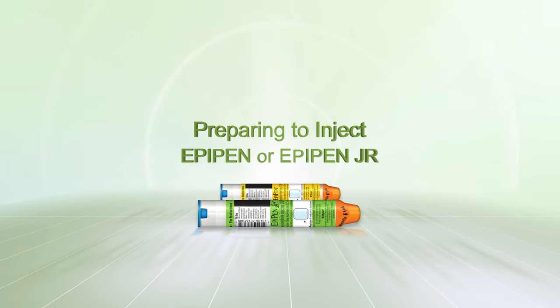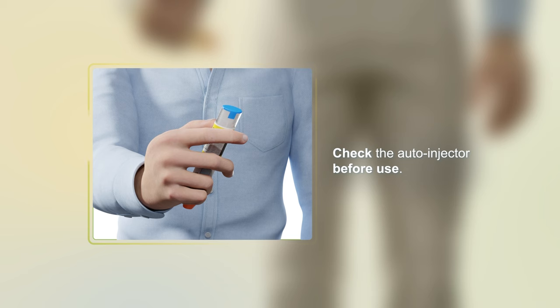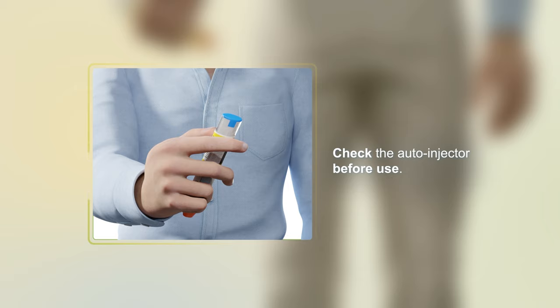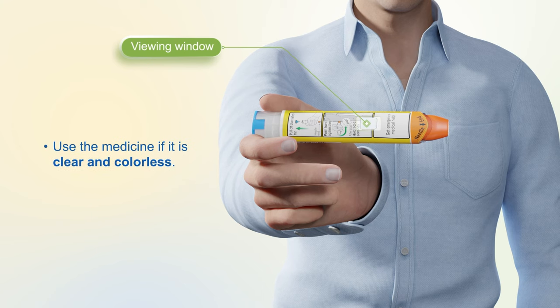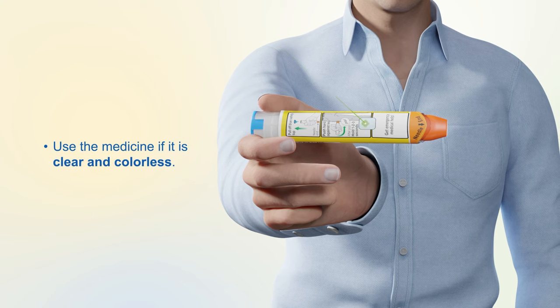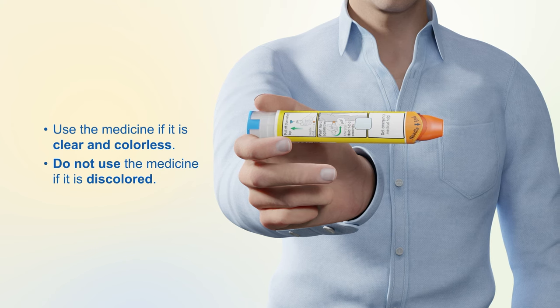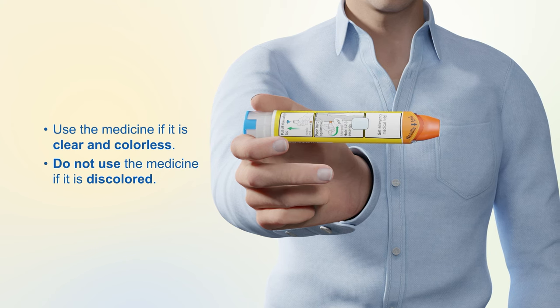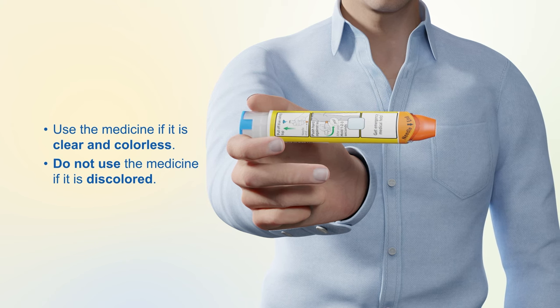Preparing to inject EpiPen or EpiPen Jr. Check the auto-injector before use. If the auto-injector appears damaged, throw it away and do not use. Check the medicine viewing window. Use the medicine if it is clear and colorless. Do not use the medicine if it is discolored, pinkish, or brown, or if the medicine has particles floating in it. Throw it away and use a new EpiPen or EpiPen Jr. auto-injector.